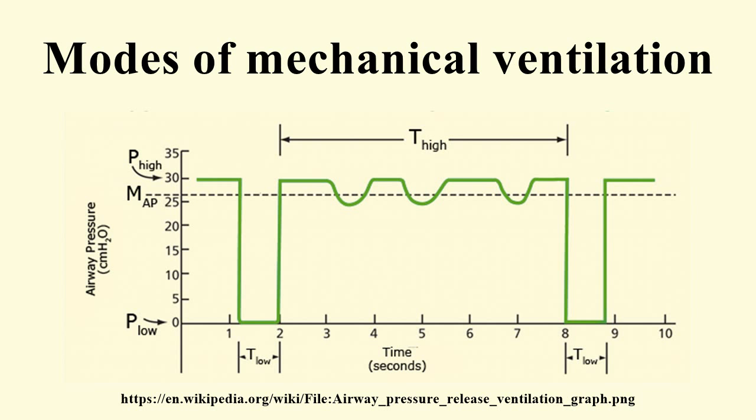A ventilator assists breathing using either pressure control or volume control based on the equation of motion for the respiratory system. Providing assistance means doing work on the patient, which is accomplished by controlling either pressure or volume. A simple mathematical model describing this fact is known as the equation of motion for the passive respiratory system. Pressure equals elastance times volume plus resistance times flow. In this equation, pressure, volume, and flow are all continuous functions of time. Pressure is actually a pressure difference across the system. Elastance and resistance are parameters assumed to remain constant during a breath.